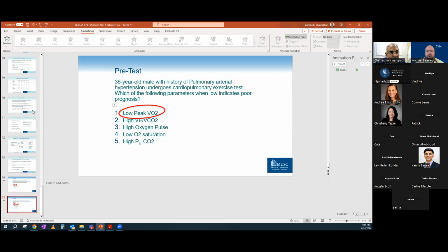And I've shown that their cardiac output is normal and their pulmonary pressures are normal. So the EF is 38% or 35%, but they have a completely normal cardiac output and they have normal pulmonary pressures. And we know in general, these are the patients who we can safely get through an organ transplant without any issues. So I use the CPET also in that format quite a bit.